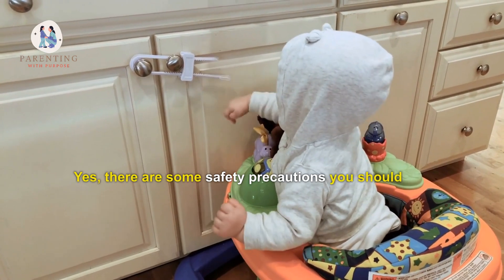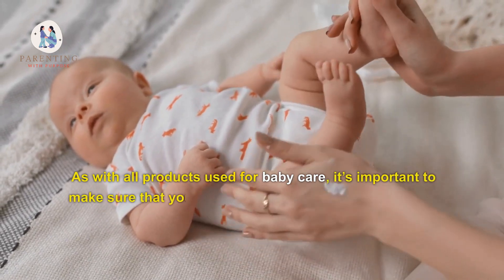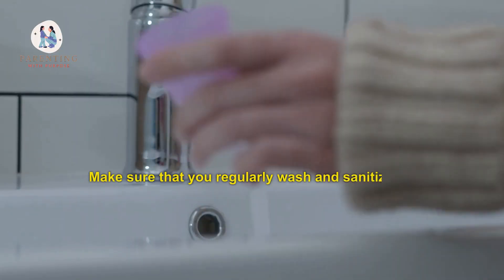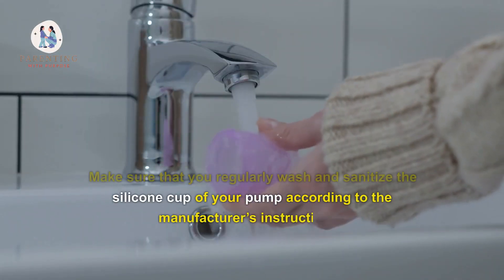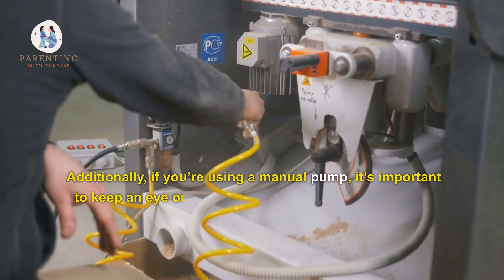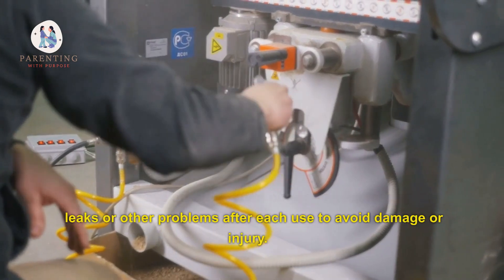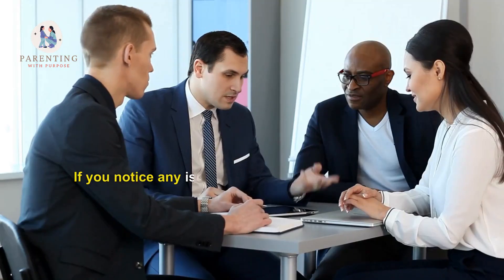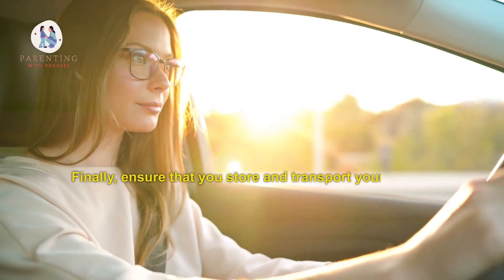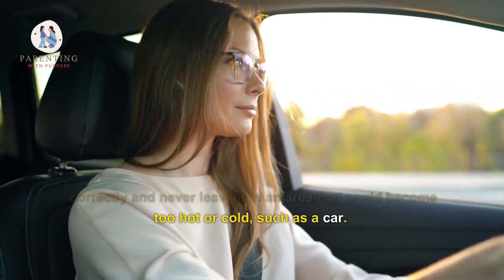Yes, there are some safety precautions you should take when using a Hakaa. As with all products used for baby care, it's important to make sure that your Hakaa is clean and safe before use. Make sure that you regularly wash and sanitize the silicone cup of your pump according to the manufacturer's instructions. Additionally, if you're using a manual pump, it's important to keep an eye on the suction power and check for any air leaks or other problems after each use to avoid damage or injury. If you notice any issues, stop using the pump until they are resolved. Finally, ensure that you store and transport your Hakaa correctly and never leave it in an area that could become too hot or cold, such as a car.